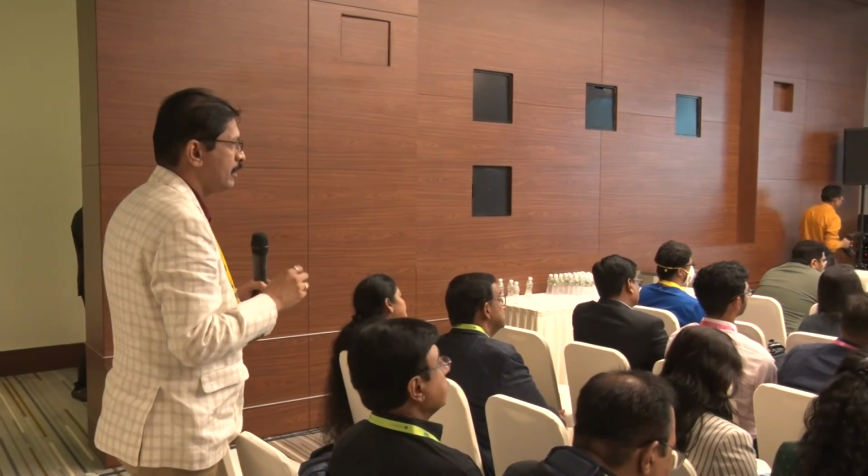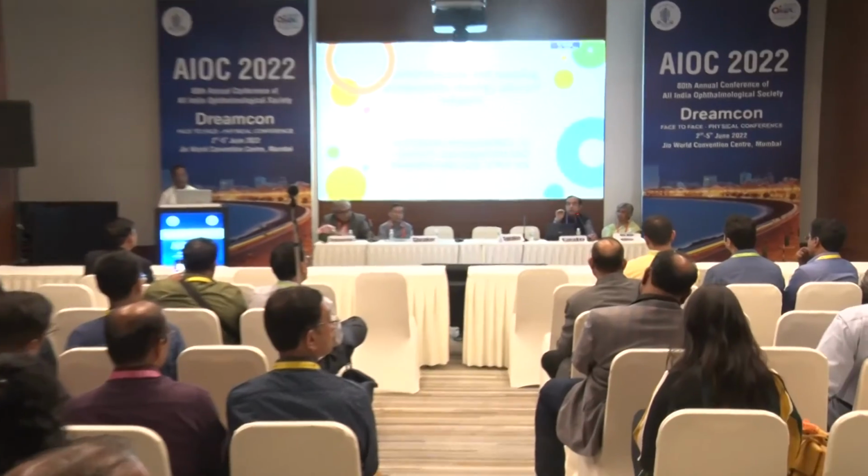No. I think when you are comparing, like I told you, because your lens size is taking 2.5, on a Pentacam you compare 2 and 3. And particularly the axis, if you see at 1 millimeter, it is the total refraction which is important. When you are talking of RK, irregular cornea is entirely different, because there is more flattening. In a regular cornea, usually pupil size should be your guide. That means if pupil size is 2 millimeter, 2 millimeter will be better than taking 1 millimeter, because 1 millimeter is too small.